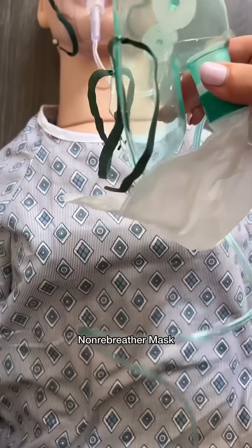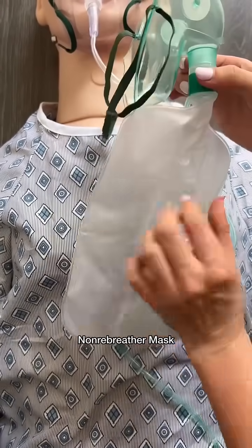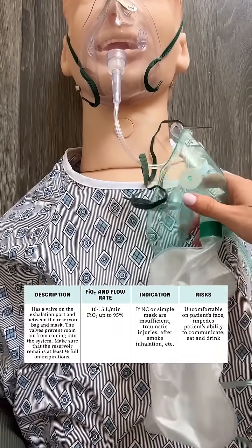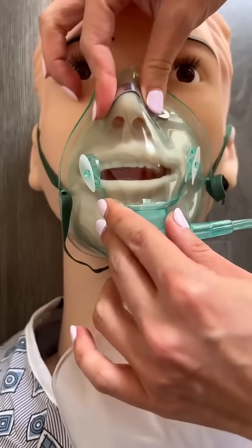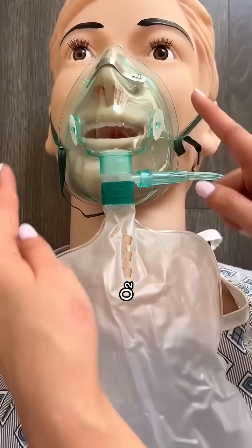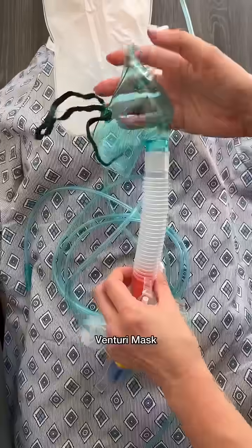A non-rebreather mask: the biggest indicator that you're looking at a non-rebreather mask is if it has a reservoir bag attached. This bag should be inflated before putting on the patient, and to do this, you fluff it out, then crank up the oxygen to fill it up. Patients are essentially non-rebreathing their CO2, so they only inhale oxygen from here, and exhaling leaves from here. We use this for smoke inhalation, traumatic injuries, and when the other two have failed.